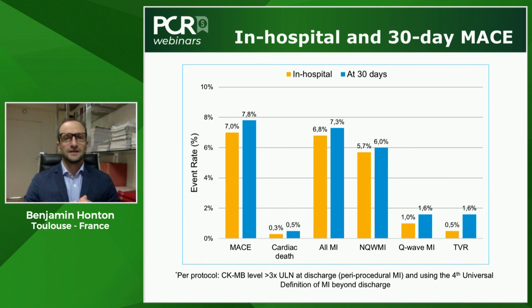So it's a very safe procedure. Next. And when we focus on the primary safety endpoint, which was 30 days MACE, you can see that there is only 7.8% of MACE, which are mainly driven by periprocedural infarction. So something which is very safe during the procedure and very safe during the follow-up. Next.